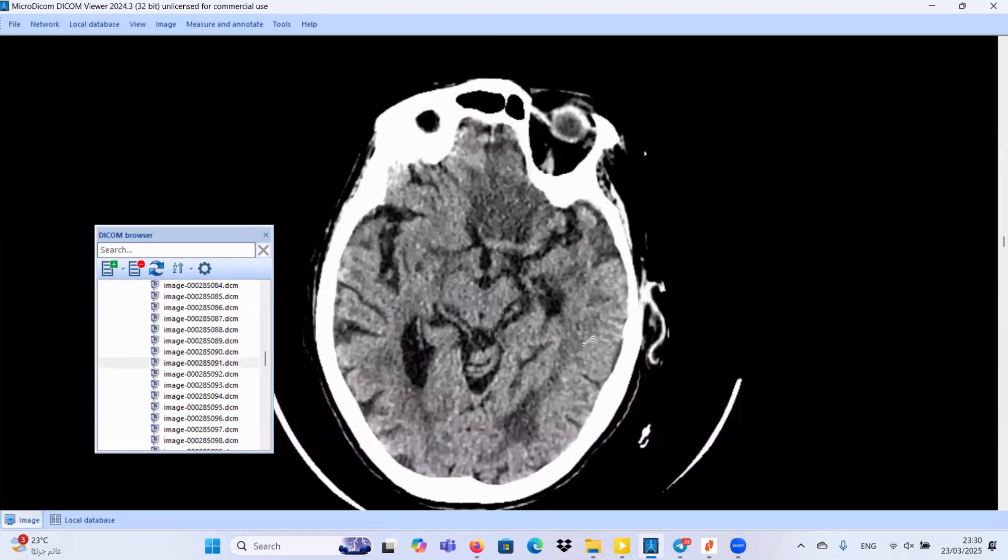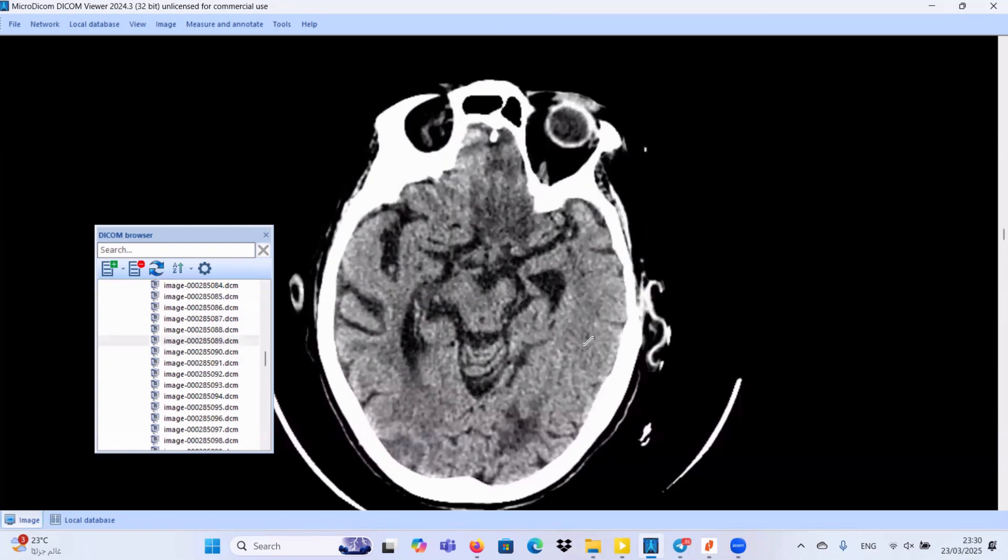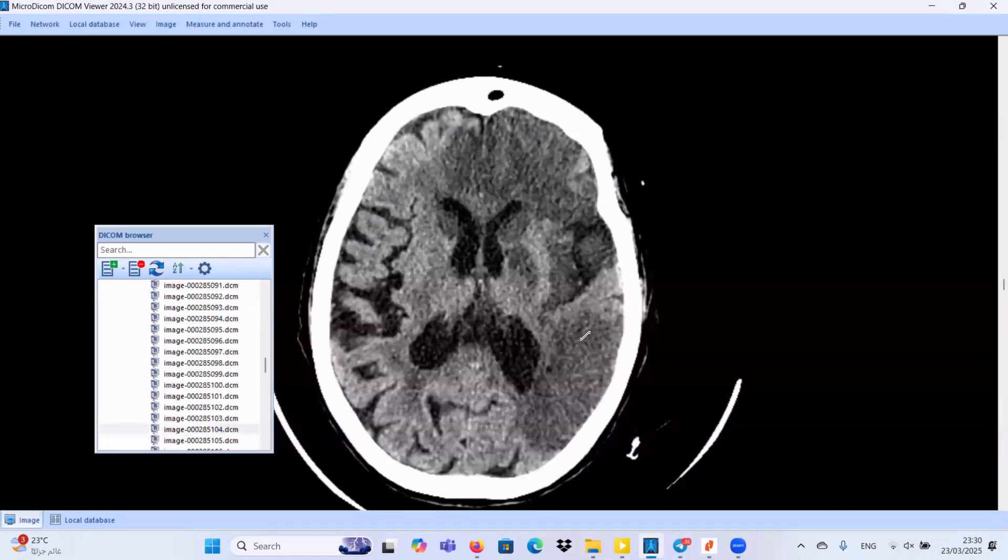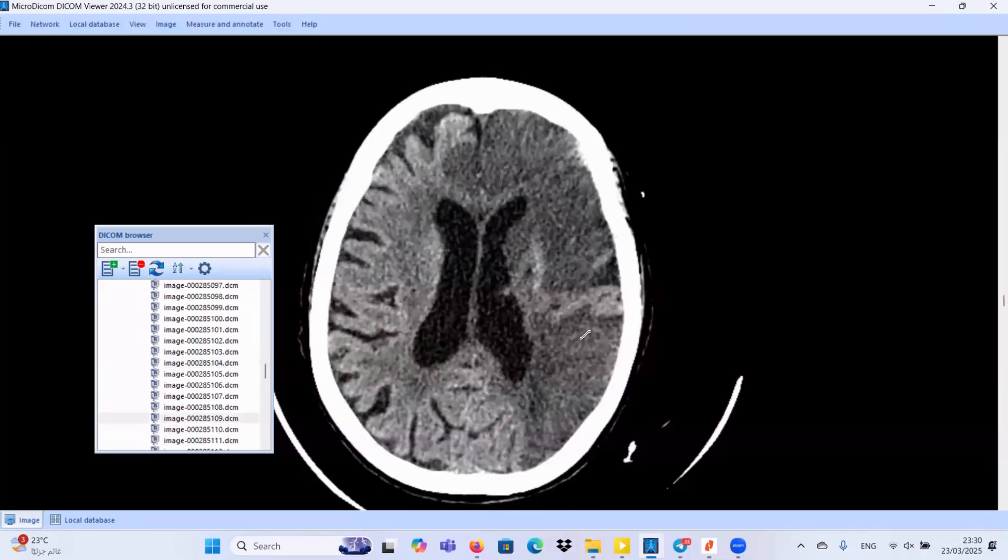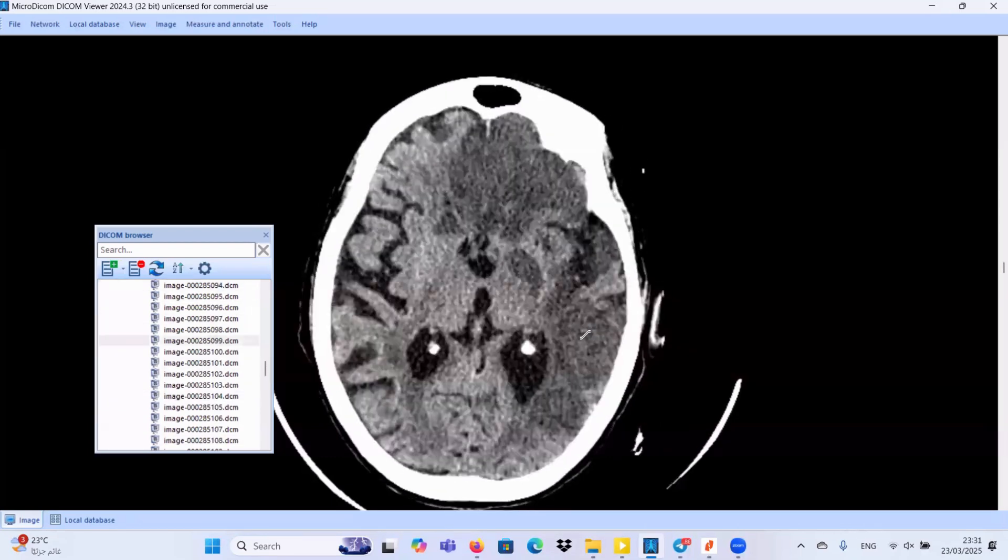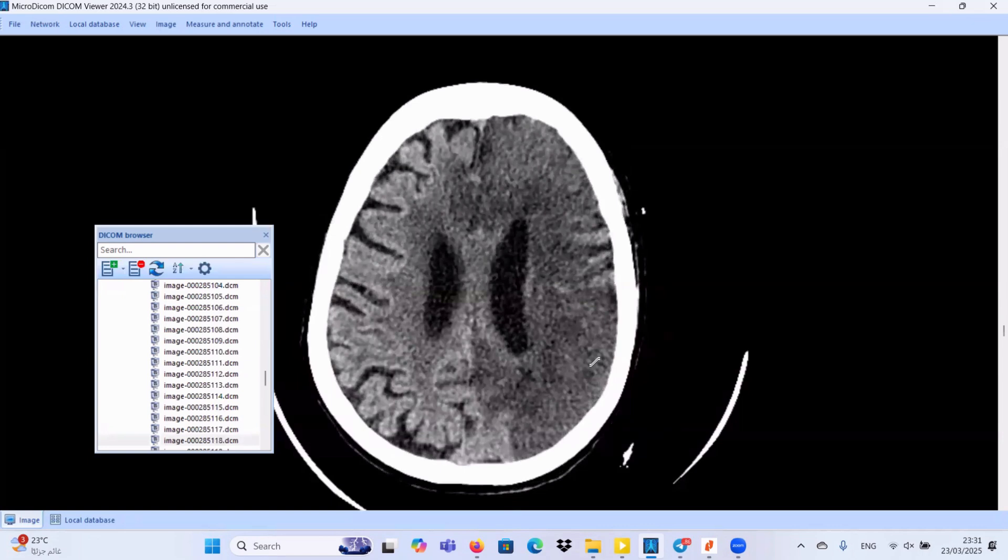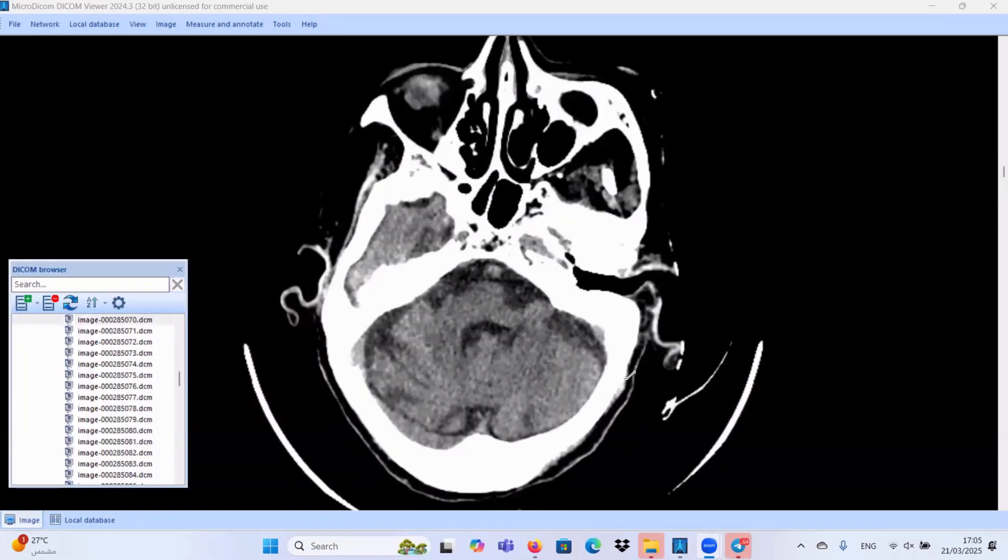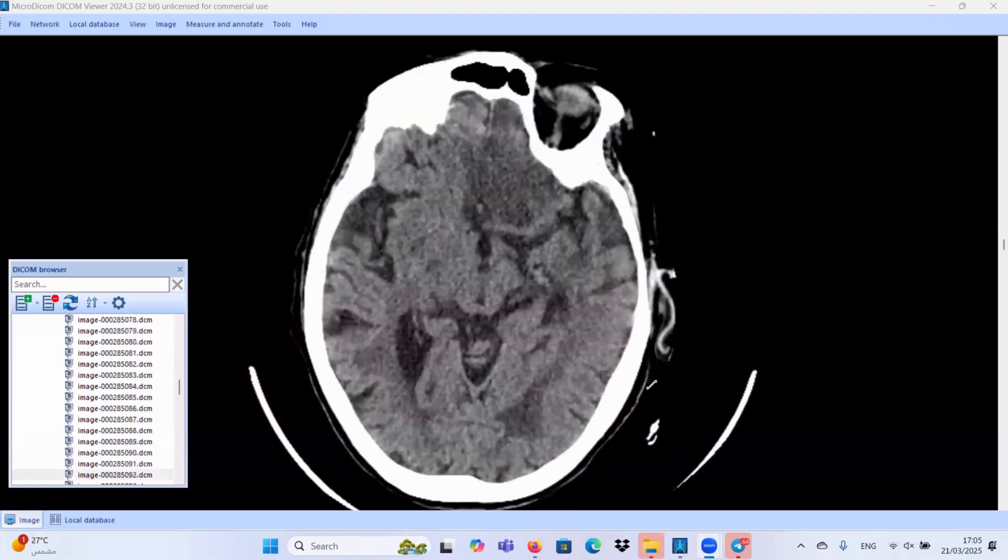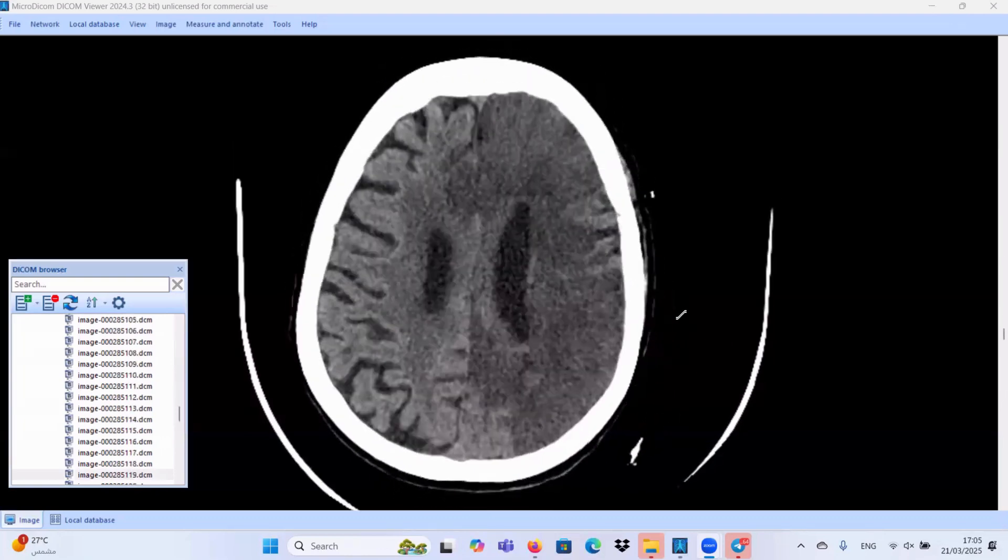To complete our findings, we have an area of encephalomalacia at the left occipital region. We have also bilateral periventricular hypodense patch areas denoting chronic small vessel ischemic changes. This is our last teaching point here in this case. I hope you enjoyed our cases today and have a nice day. Thank you.